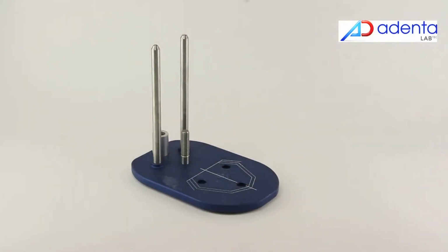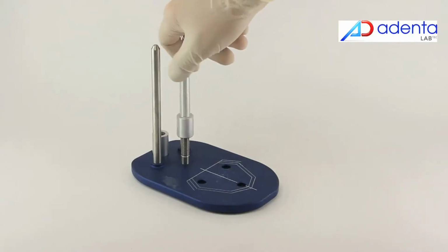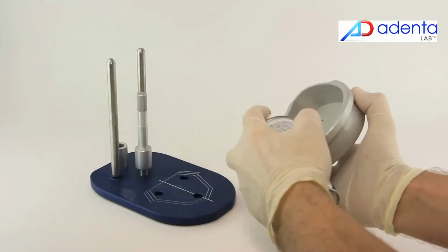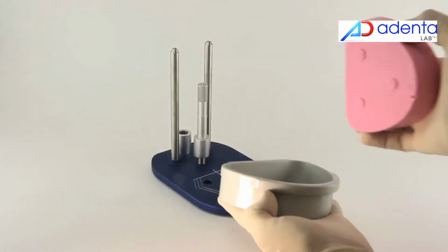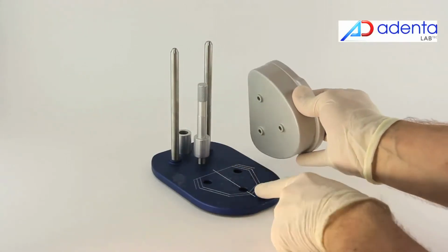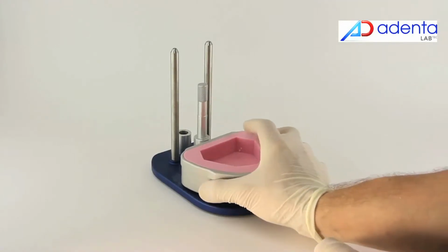The height adjusting screw is placed. The isolating material is added to facilitate the plaster cleaning. Using the 3 guides at the bottom of the tray for silicon molds, the tray is positioned into the system base.